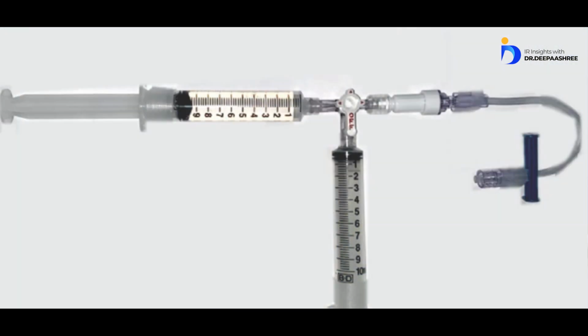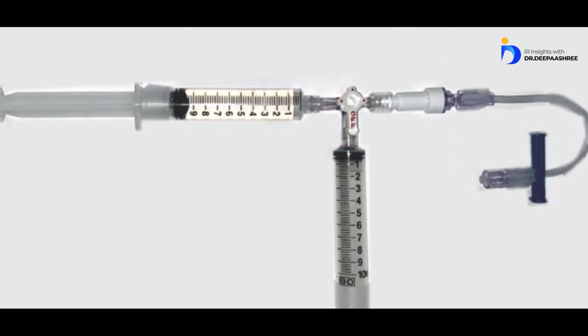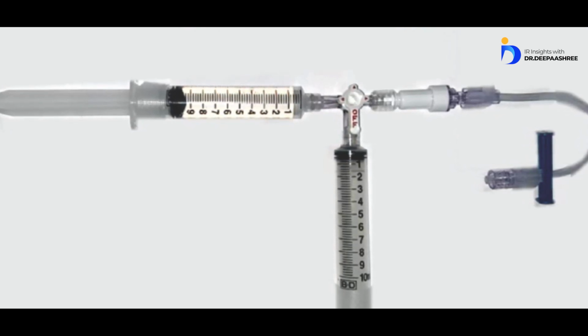Or if it's the top, then you put some contrast. So then you see how it goes. And then when you take it up and see if it's a uniform distribution, then when you're injecting this gel foam, always use pulsatile technique. Don't just keep pushing the syringe totally off and then say this is what happens. So use the small, you need to have this pulsatile technique.